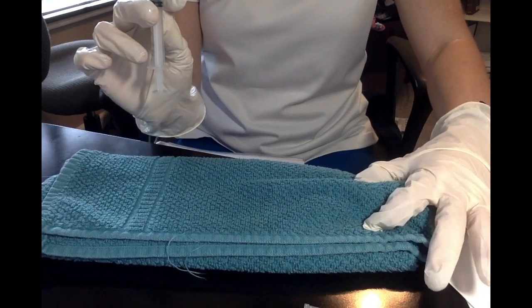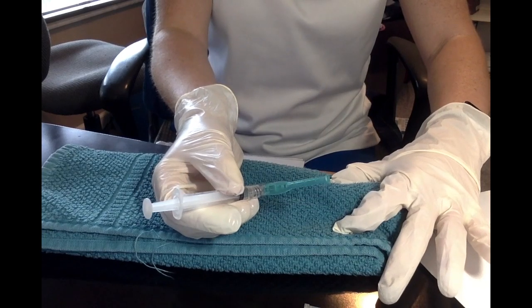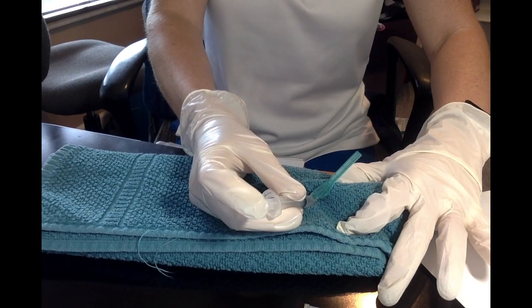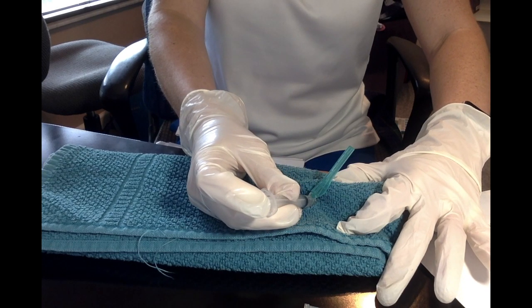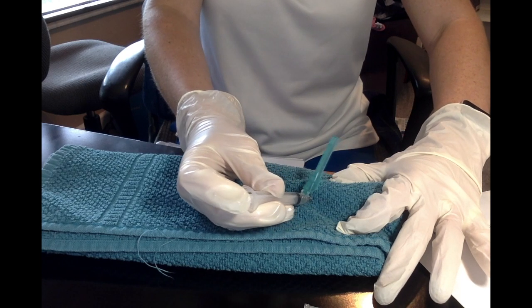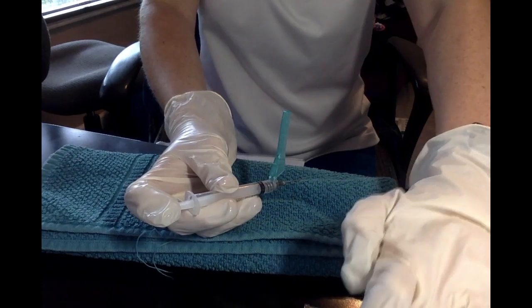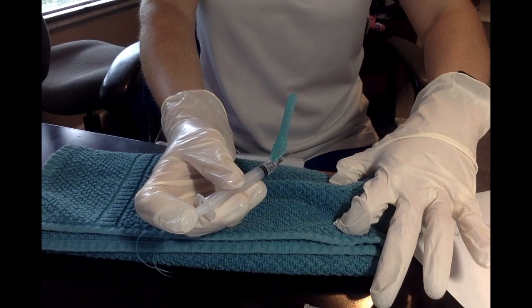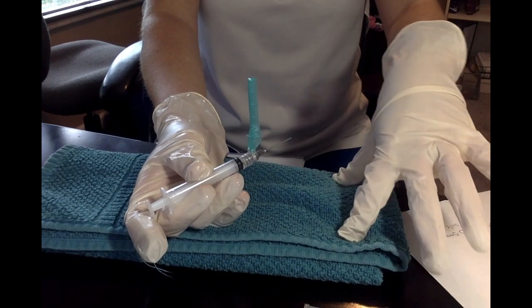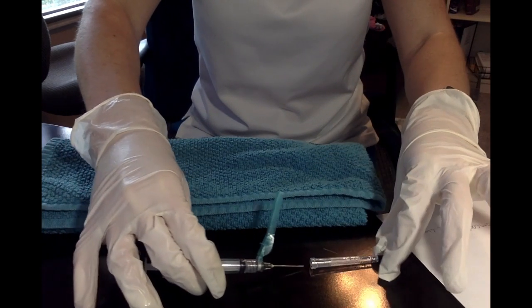We're going to pinch the skin, and I can pinch 1 inch. So I'm going to go in at a 45-degree angle. I'm going to hold it like a dart, insert it, and I'm going to inject slowly. And then I'm going to release it. I would hold it in there for 5 to 10 seconds, and then I would pull it back out, and then I would engage the safety, but I want to reuse this needle, so I'm just going to recap it. So you would release the skin, and then you would recap it doing this again.